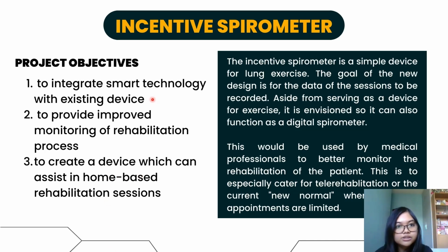1. To integrate smart technology with the existing device. 2. To improve monitoring of the rehabilitation process. And 3. To create a device which can assist in home-based rehabilitation sessions. The goal of our new design is for the session data to be recorded, and so our circuits are designed to function as a digital spirometer.